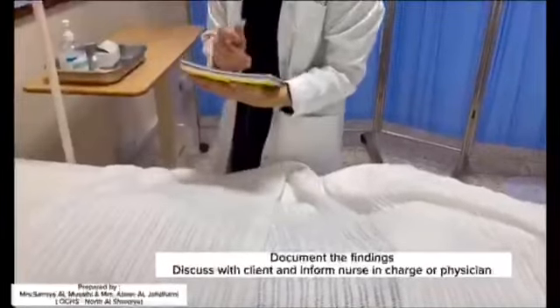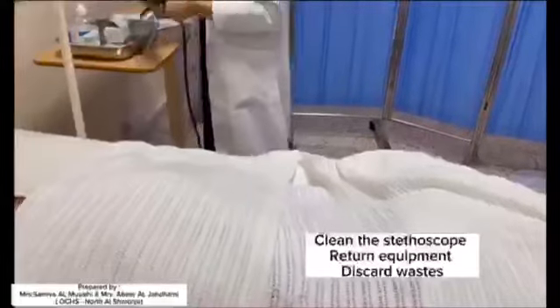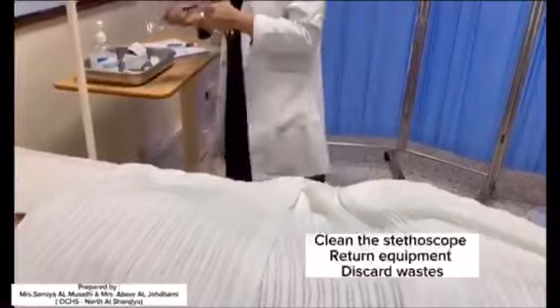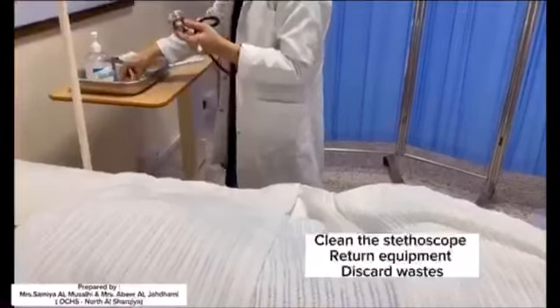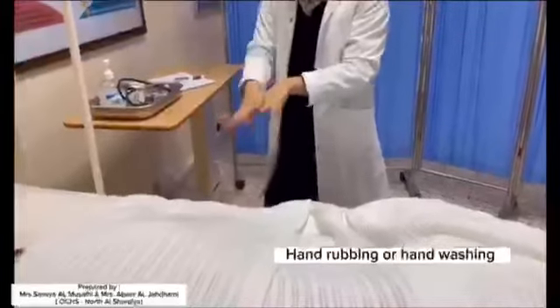Discuss with client and inform nurse in charge or physician. Clean the stethoscope, return equipment, discard waste. Hand rubbing or hand washing.